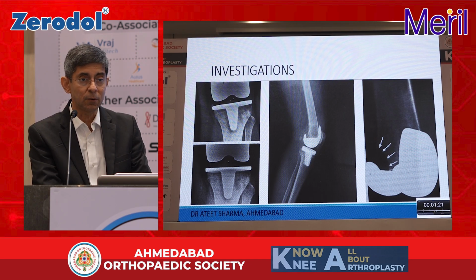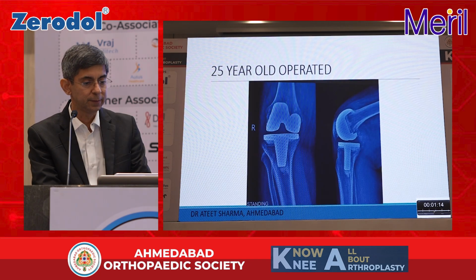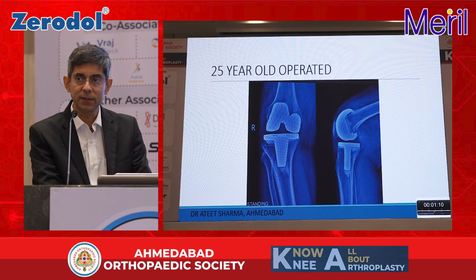In the femur, there is a lot of osteolysis just above the femoral component, and the third one is posterior osteolysis. So this is the 25-year-old operated. You can see the medial subsidence as well as lateral loosening.